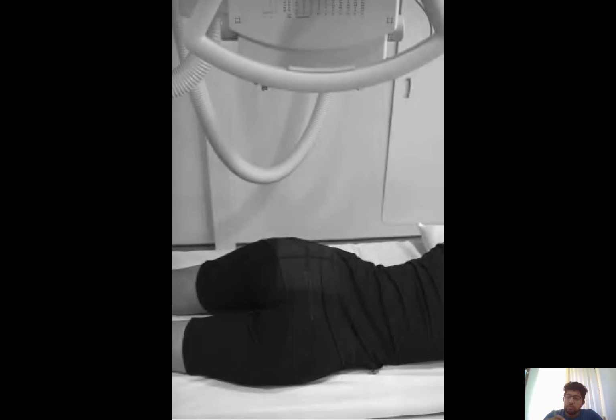Now, the AP view gives the information about the roof and floor of the acetabulum, and any fracture in the roof and floor can be detected by the AP view. The posterior oblique gives the posterior wall of the acetabulum, and Judet's view gives the information about the anterior wall of the acetabulum.